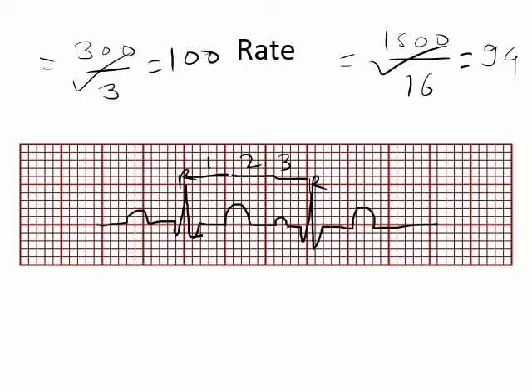But you might want to remember both of them, as this one will be useful in diagnosing if the patient has tachycardia. However, this one will be the one that will help you quantify it. Now again, I'm really sorry, but I'm going to erase everything on this slide to tell you a simpler, perhaps a very simple method to calculate rate.